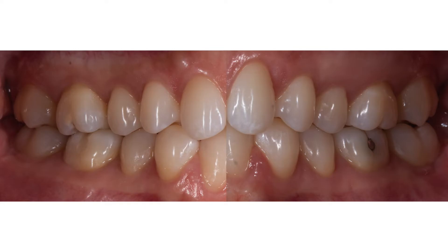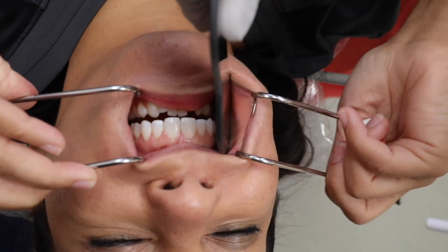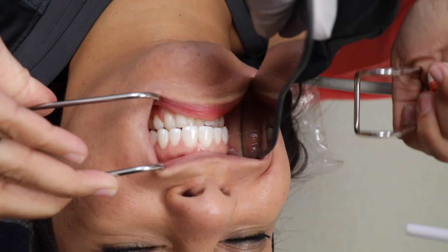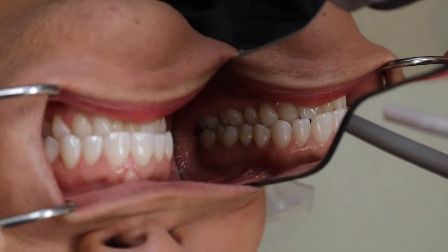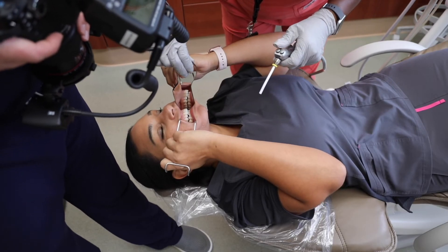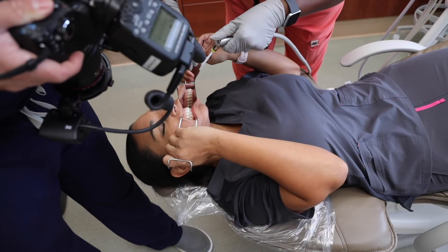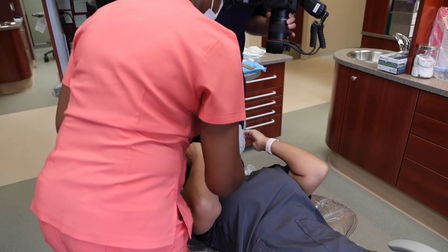For the buccal images, the teeth are together in maximum intercuspation and the occlusal plane in the image is parallel to the upper and lower border of the frame. My goal is to capture at a minimum from the canine to the most distal tooth in the arch. Focus on the first or second premolar area. You need to angle the mirror out away from the sides of the posterior teeth to capture the best orientation. The patient still has a retractor in for the opposite side — they should not retract too hard, as it limits how much you can retract with the mirror. Take these images for both the left and right sides.